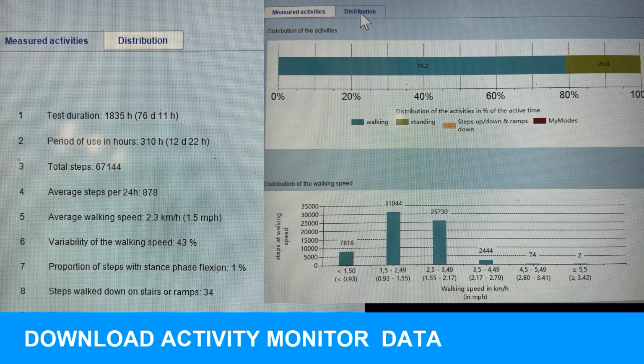If you guys can remember this, I don't know if I do it all the time, but if you know your patient's going for osseointegration, turn on your activity monitors on the knee for us. It only lasts 6 months, but this is free information.